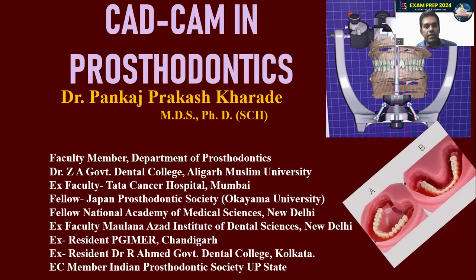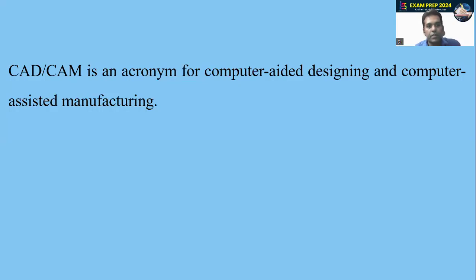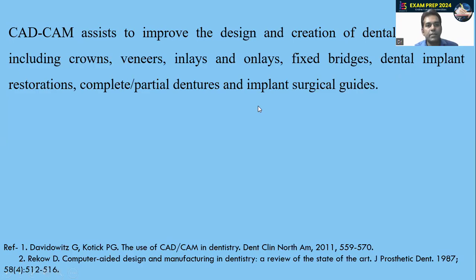Myself, Dr. Pankaj Kharade, and today we are going to discuss CAD CAM in prosthodontics. As we all know, CAD CAM is an acronym for Computer-Aided Designing and Computer-Assisted Manufacturing. CAD CAM assists to improve the design and creation of dental prostheses, including crowns, veneers, inlays, and onlays, fixed bridges, dental implant restorations, complete or partial dentures, and implant surgical guides.